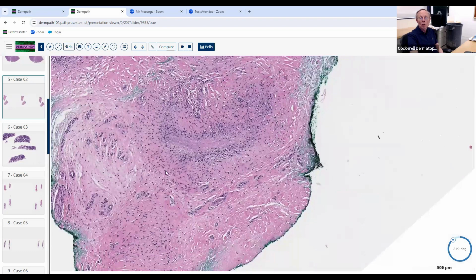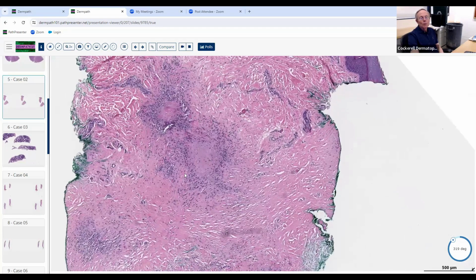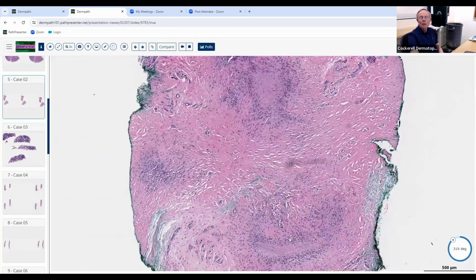It's really mostly in the dermis, and these usually present as relatively deep looking plaques or nodules, often on areas near acral skin. Achilles tendon area, for example, is a good location for this, and they're often seen in kids. And so we call it subcutaneous GA, but it's really not subcutaneous GA. So hopefully that's helpful. Again, you don't have to become a soft tissue pathologist.